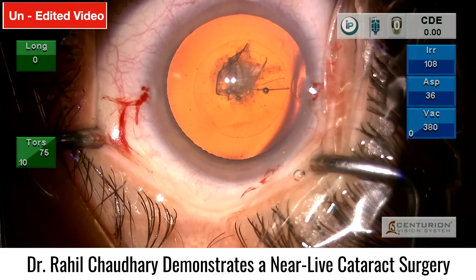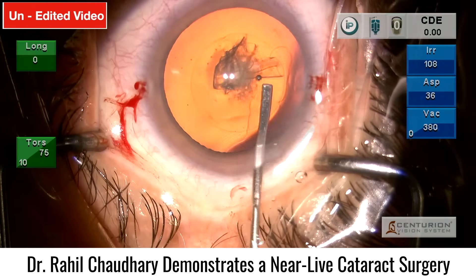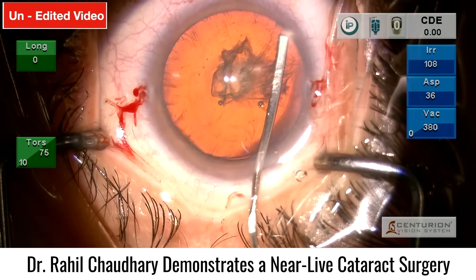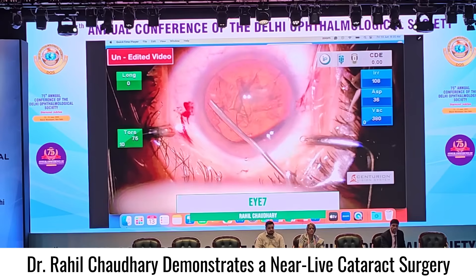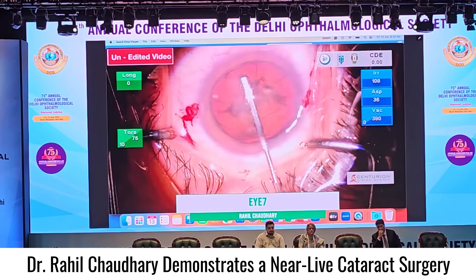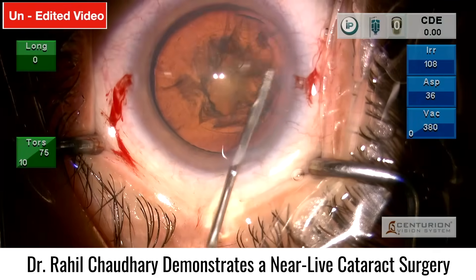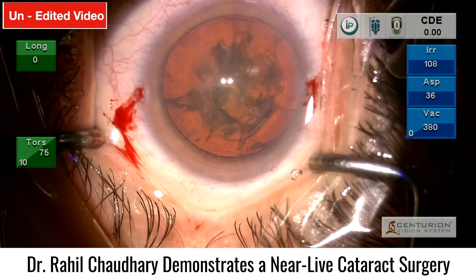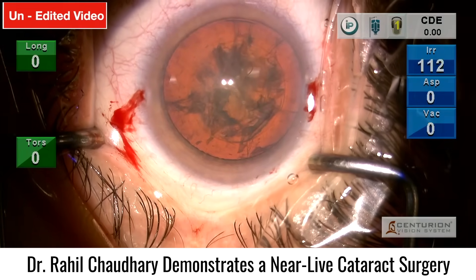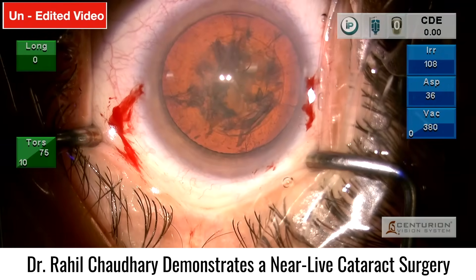Like any other routine cataract surgery, we are now doing hydrodissection and hydrodelineation, separating the lens from the capsule. A few more bursts just to make sure the lens is nice and loose from the capsular bag. Now proceeding with phacoemulsification.